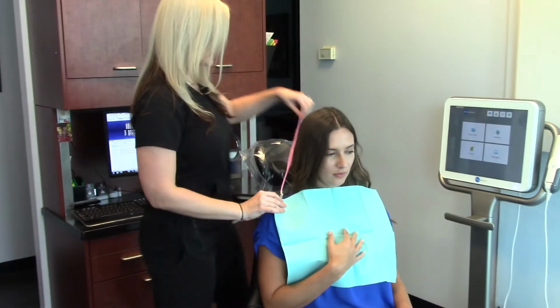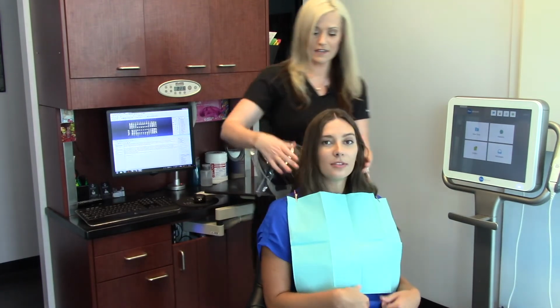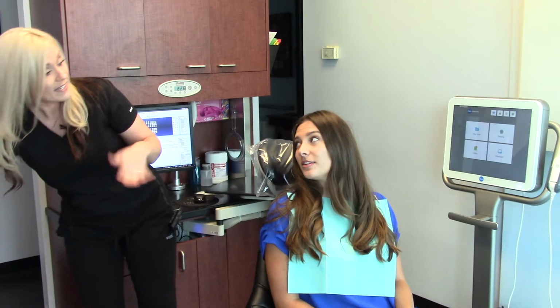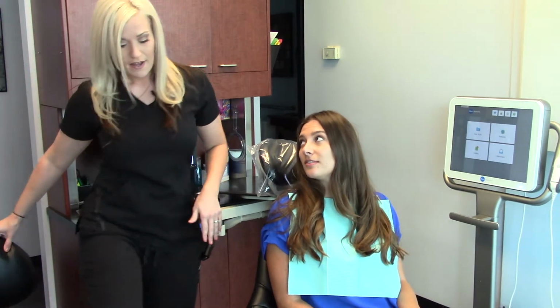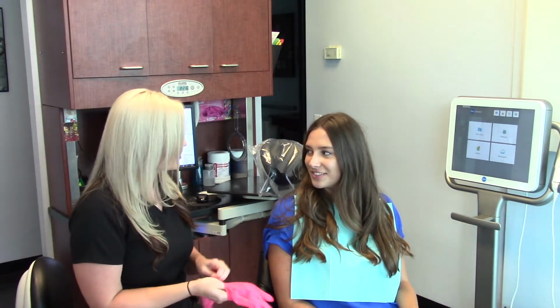In addition to the cleaning, we will also be doing a computerized mold of your teeth, okay? And that way, we can go ahead and get a baseline for the mold of your teeth with our iTero machine, okay? Awesome. It's a 3D scanner. It's brand new technology we have here at Jackson Dental, okay? Awesome. Sounds good. So let's go ahead and get started with your x-rays.